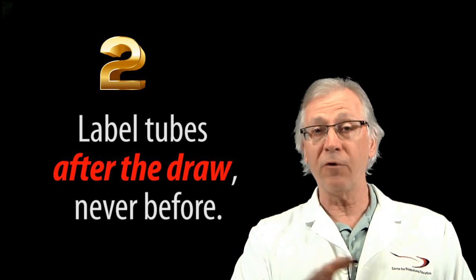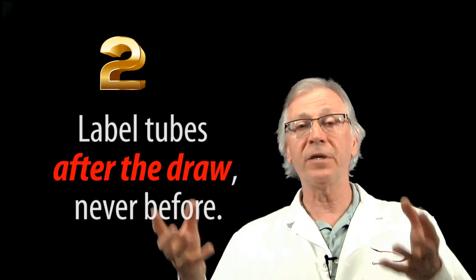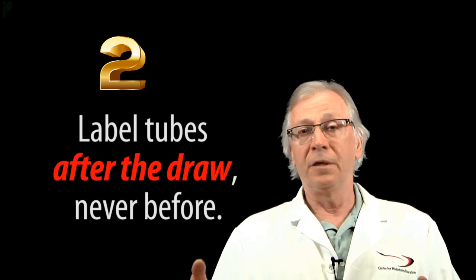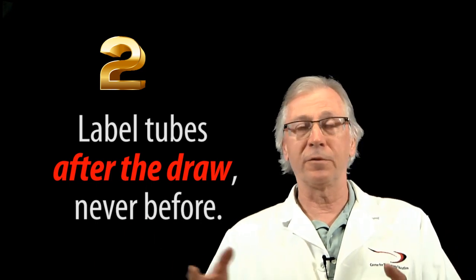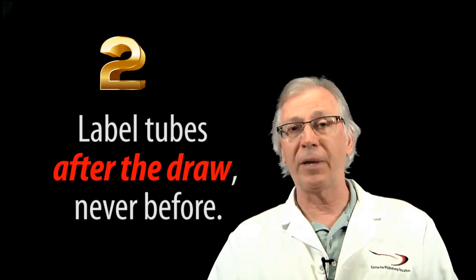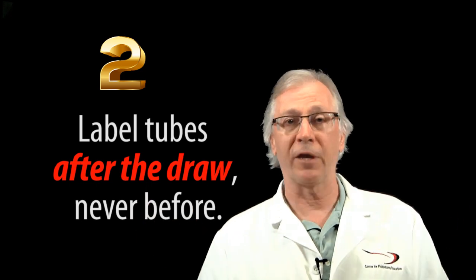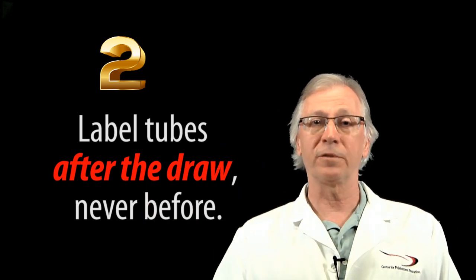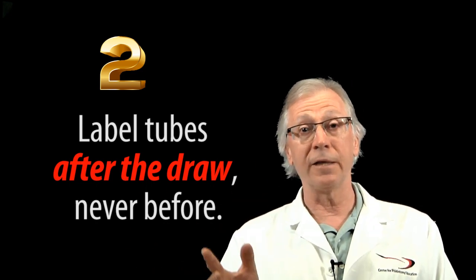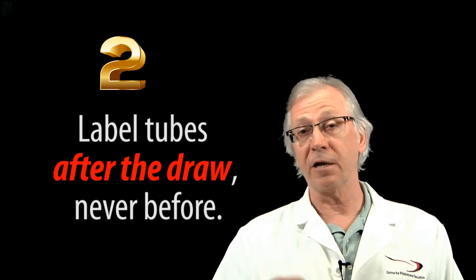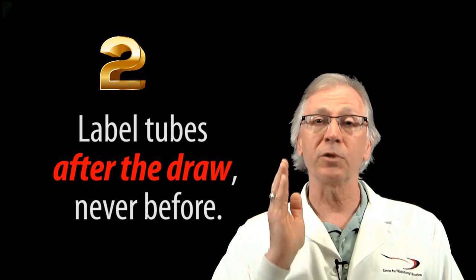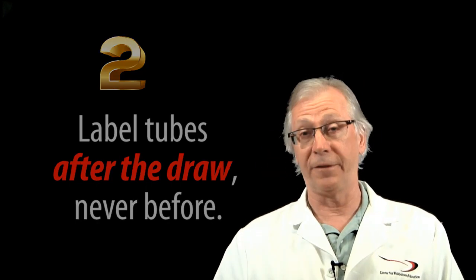That's because if they're labeled before the draw, and they end up not being filled for whatever reason—a difficult stick, unable to locate the vein, the patient passes out, a short draw, a combative patient, any number of things—and then you've got empty labeled tubes laying around that could potentially be used on someone else, should they not be discarded. So label tubes only after they have blood in them.